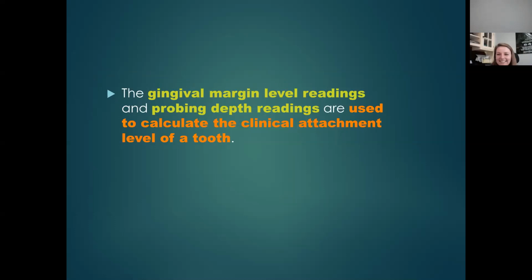Dentrix and the other programs that are out in private practice will calculate the CAL automatically for you. We have taken that function away. So each of your computers, no matter what campus you're at, should have you calculating the CAL manually, because we want this to be so ingrained in you that you understand it and you don't even have to think about it by the time you take your boards, because on your boards, they will be asking you to calculate CAL. And oftentimes you have to go searching through a case study.